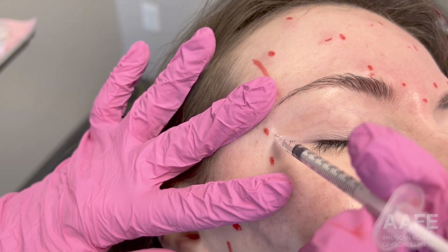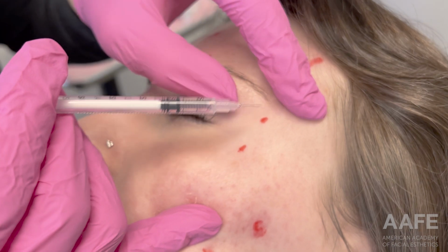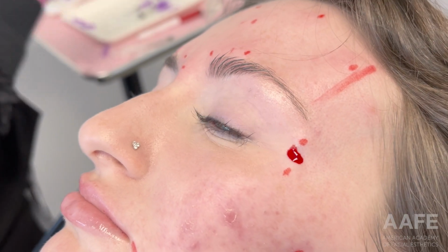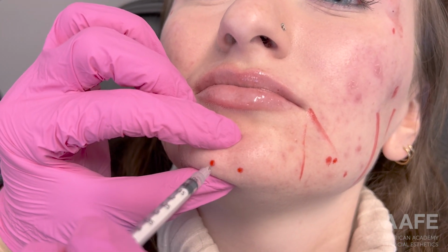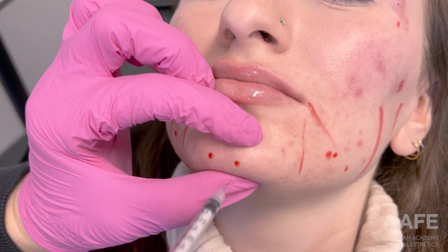Now I'm injecting the orbicularis oculi and I inject up and away. I hold that skin really, really taut because if a patient is going to bruise from Botox, which they will, you can see right there, she'll have a little bruise. It's nice to hold it taut so that you can see if there are any prominent vessels right there.